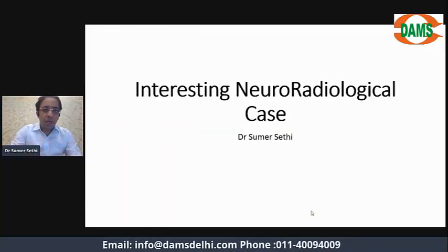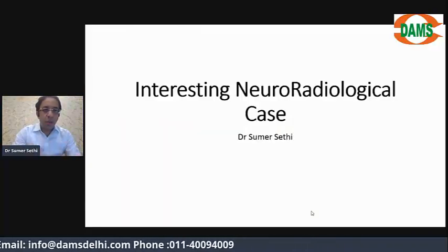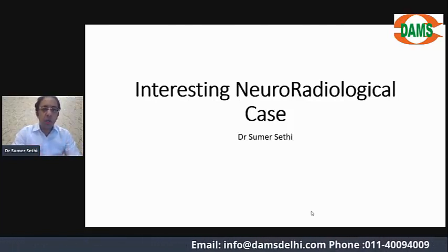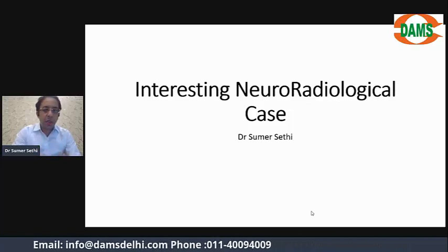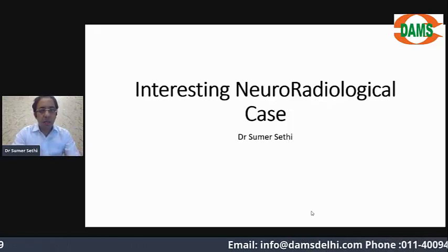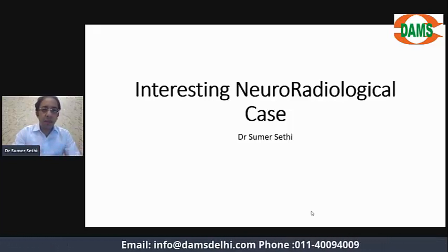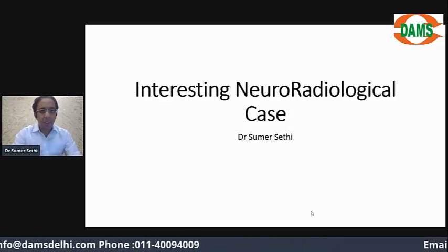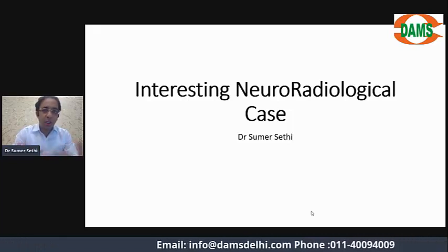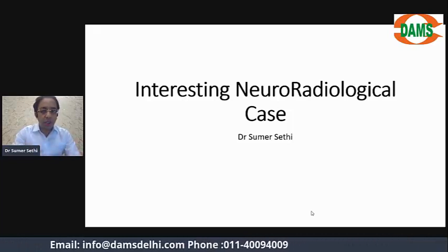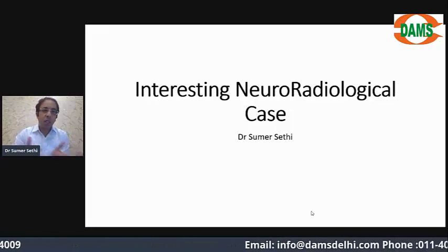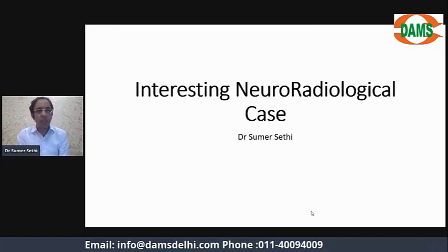Hi friends, we have initiated a series on YouTube where we discuss interesting clinical cases. Today I'll discuss an interesting neuro-radiological case, showing how radiology helps in the diagnosis of unusual cases — and many times it has treatment implications as well. I'm intentionally not telling you the diagnosis in the first slide because I want you to think along with me. I will look at the case on the workstation, just like you'd see in a real hospital scenario.